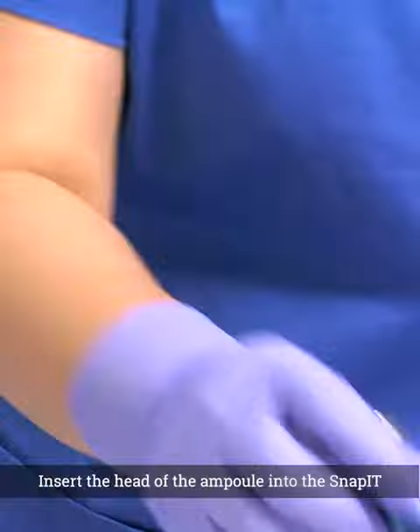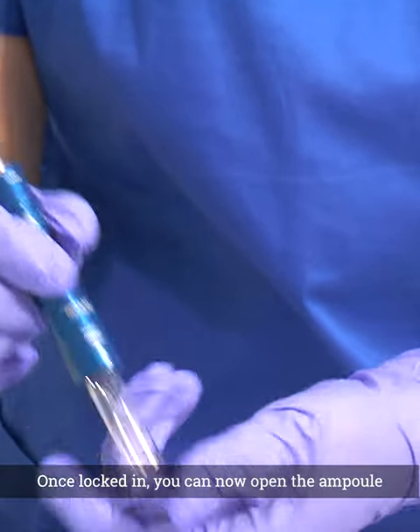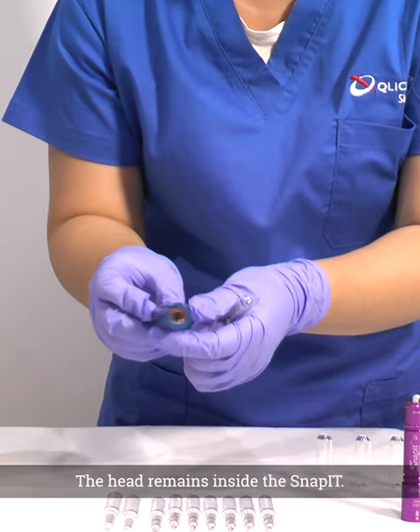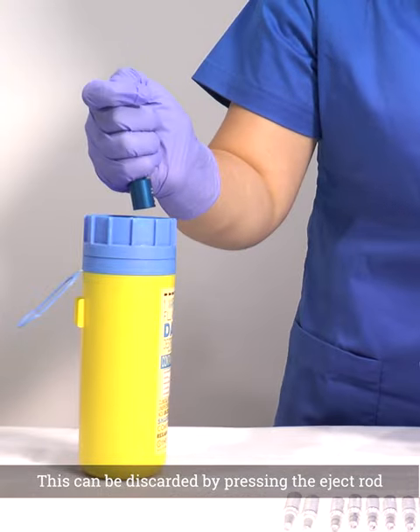Insert the head of the ampoule into the Snap-It, aligning the dots with the score line. Once locked in, you can now open the ampoule by snapping away. The head remains inside the Snap-It. This can be discarded by pressing the eject rod over a sharps bin.